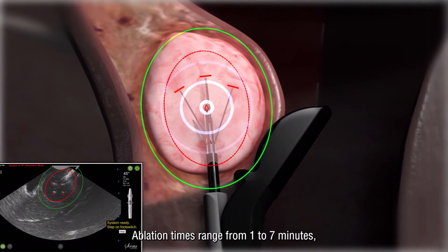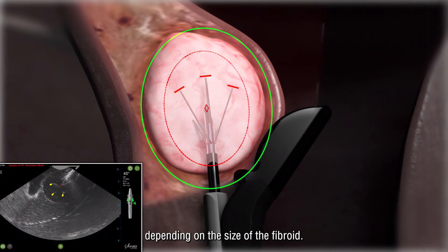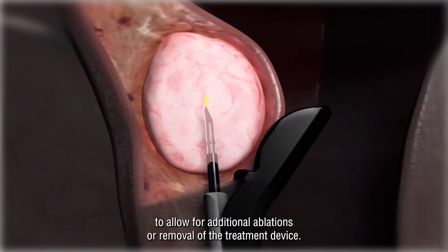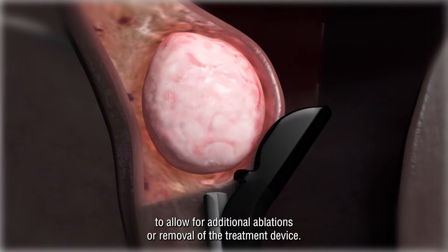Ablation times range from 1 to 7 minutes depending on the size of the fibroid. The needle electrodes and introducer are retracted to allow for additional ablations or removal of the treatment device.